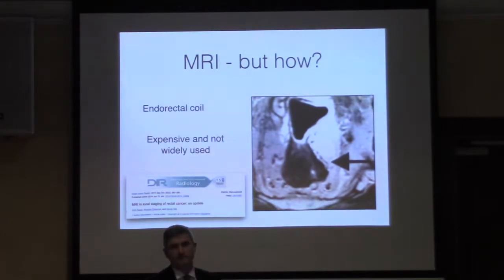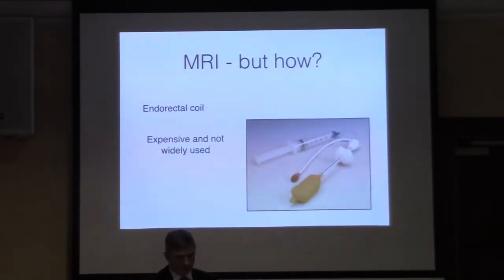It's expensive. Not many people are using it. That might be because of patient compliance. It's not the most pleasant thing to have done. And so the vast majority we're going to be using surface coil. Some people will use a cardiac coil wrapped between the legs to give you better signal to noise ratio. And that will depend partly on the equipment that you have, and time and technology experience.